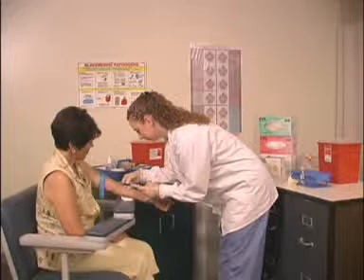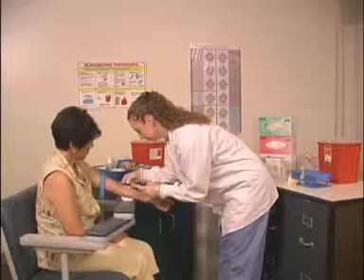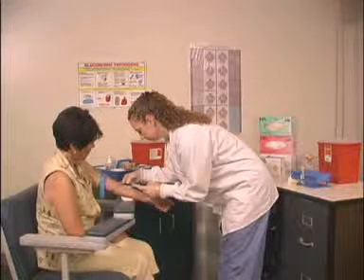The establishment of blood flow is normally indicated by blood in the hub of the syringe. In some cases, blood will not flow until the syringe plunger is pulled back.